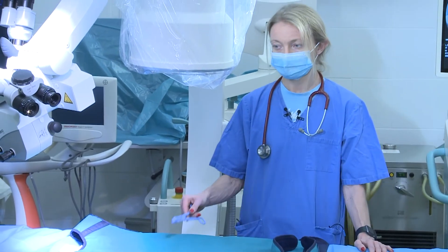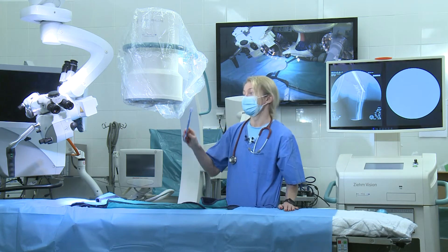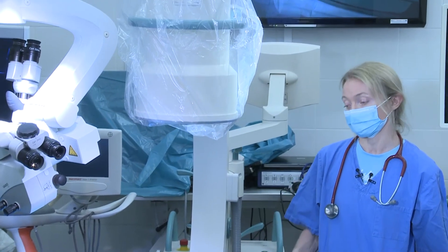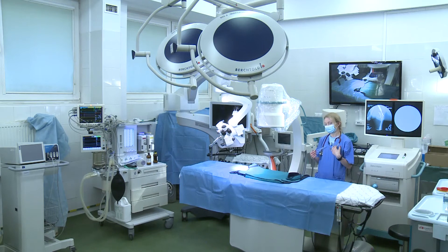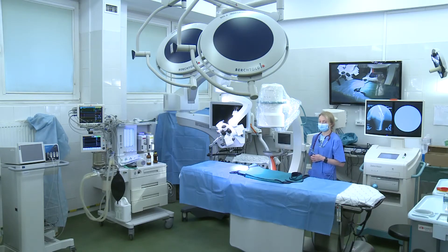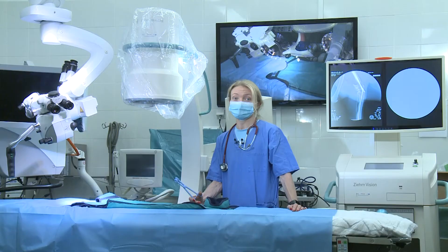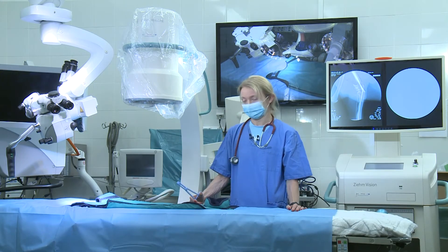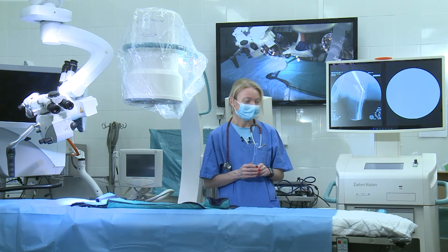It protects you, it protects your health, and it protects your life as well. Our patients stay inside the beam — the beam is very focused because it is a very modern lamp and device — but still the owner who holds the animal and you need protection. That is why we use aprons and shields to protect ourselves against additional X-ray radiation. It is not only dangerous, it is also very helpful for us as doctors, because X-ray radiation shows us what is inside our patients.